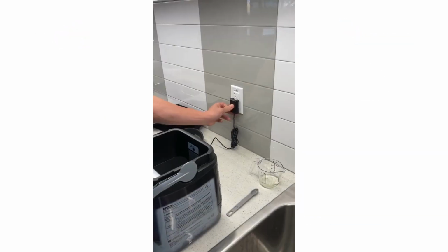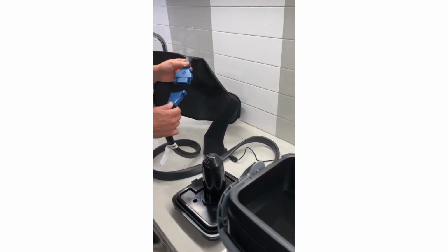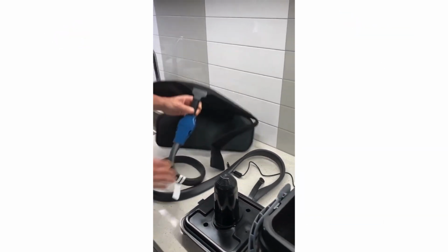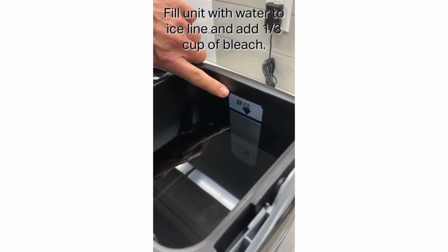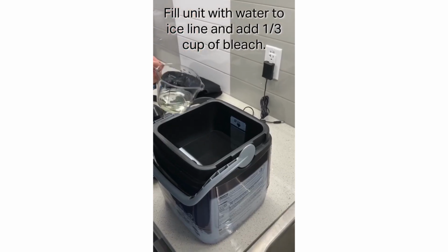Power supply into the wall. Connect the pad. For cleaning only, fill the unit with cold water to the number 2 ice line and add 1/3 cup of bleach.